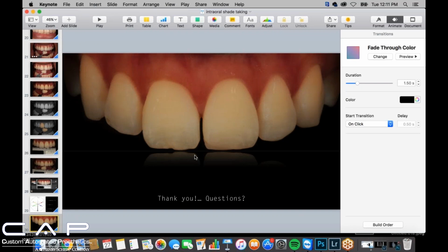But I'll be completely honest with you. Sometimes it's not as uniform as I would like it to be, which I think is why this other flash bracket comes out and you can't move it. It's stationary, so your flash is always going to be the same no matter what, so long as you position your camera to the patient the same way every time.